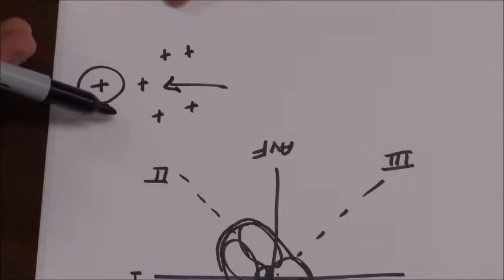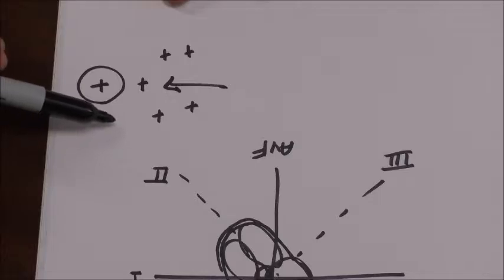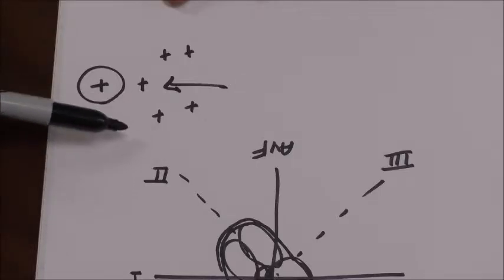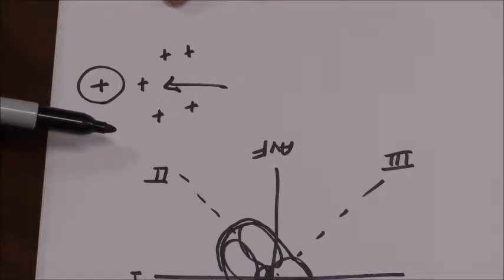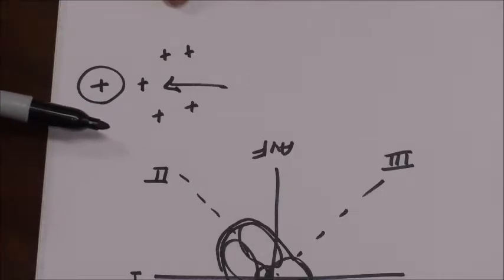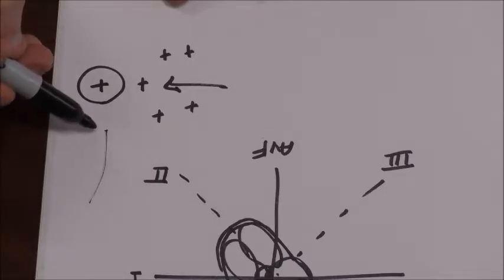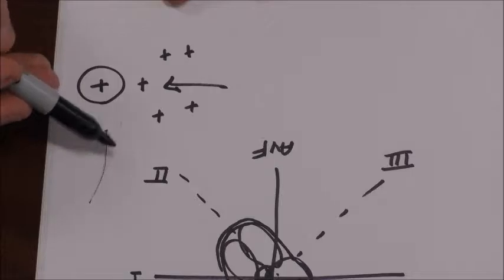Then you have kind of the similar effect that it goes towards a positive lead, and a positive lead causes a positive deflection. So in an old school EKG, in the original ones where it was like a needle with ink on a piece of paper, then the positive charge flowing towards a positively charged needle would cause a positive deflection on a piece of paper. So you can think about it that way.